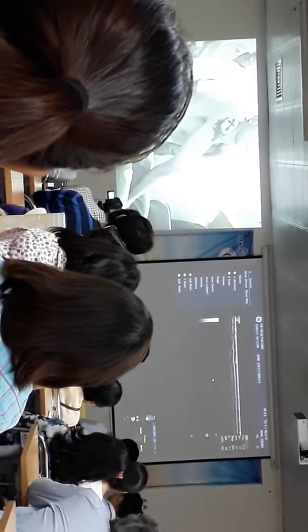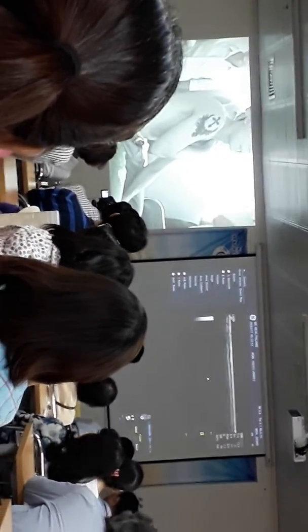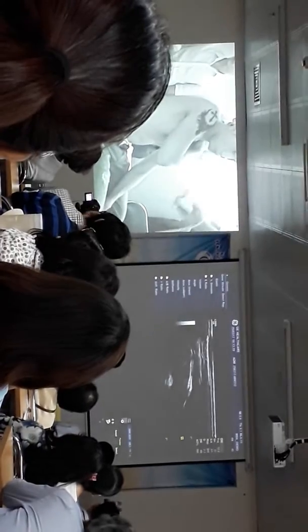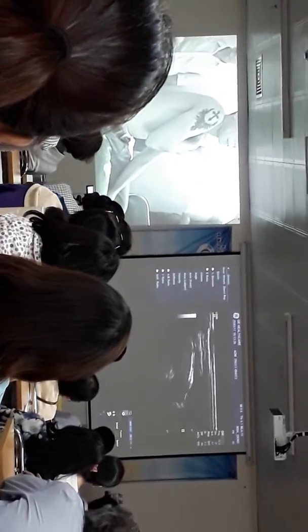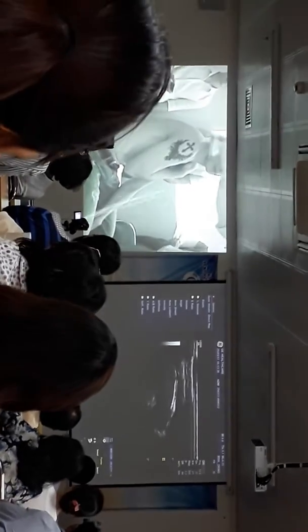And a lot of the time the patient will keep their arm out. You need to push their elbow down next to their chest. To find this, just go over down and see how he's doing this with his shoulder. We need them to relax. If the patient shrugs the shoulder up, push the shoulder down and have them relax.